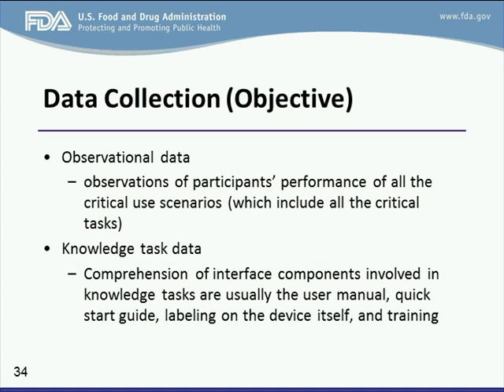Now, for certain types of use-related tasks, for example, the warnings, cautions, contraindications in the IFU, which may be difficult to quantify and format in a performance task. Now, for those types of tasks, you can format them into knowledge questions, and you can collect the participant's response to those questions and record them as knowledge task data.